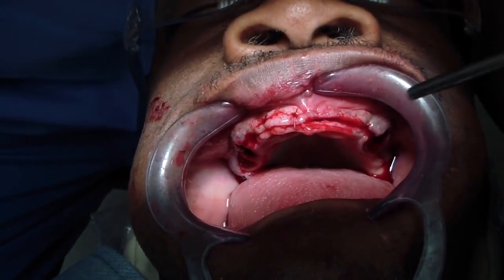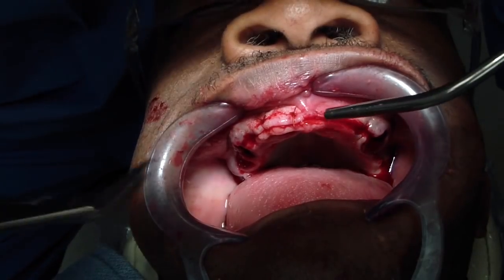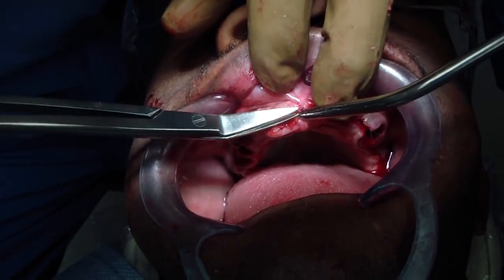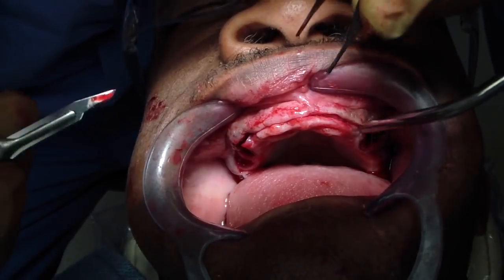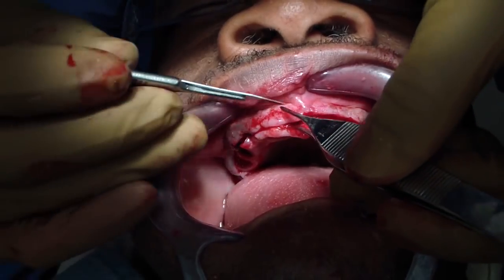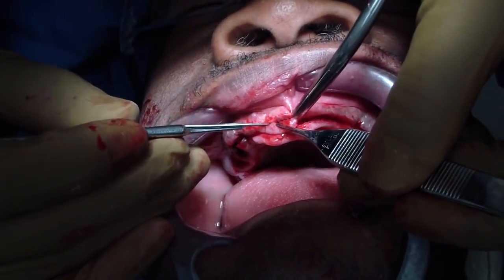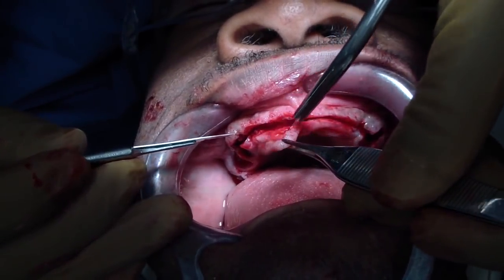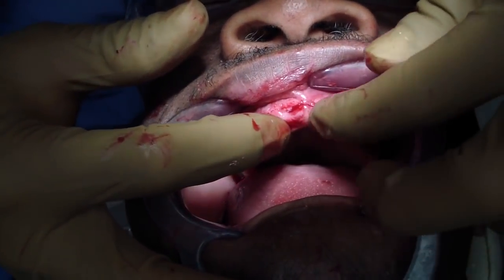Additionally, what I would have done — and Dr. Partridge was talking about this — was instead of using horizontal mattress sutures or interrupted sutures, just use one continuous running suture. The reason is, as Peterson says in his textbook, it's less discomfort for the patient because of fewer knots. That definitely rang true in this case, because each time I saw Aaron postoperatively, it was those knots that were tender when we placed the denture in and took it out. Continuing with soft tissue removal and then approximating the flaps together, trying to allow for primary intention healing.